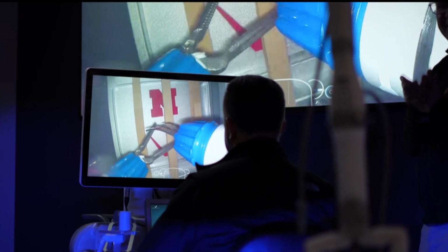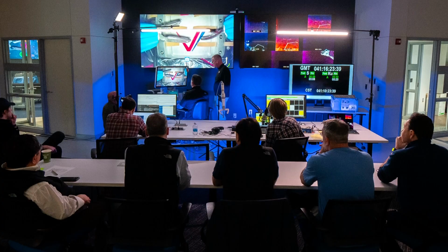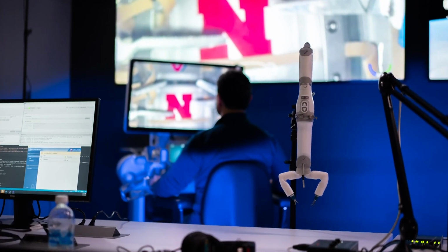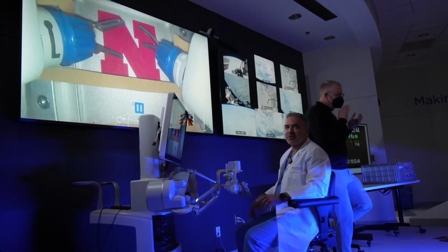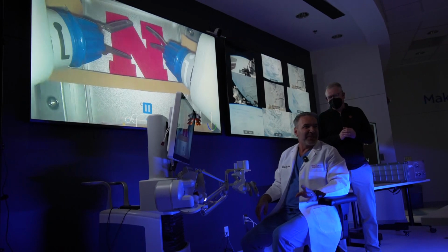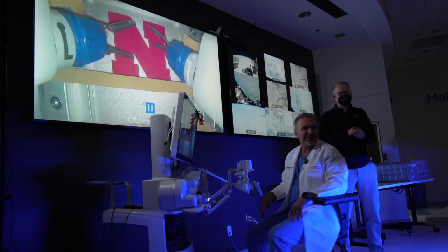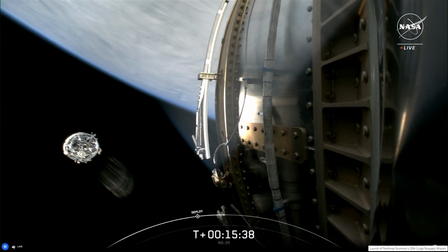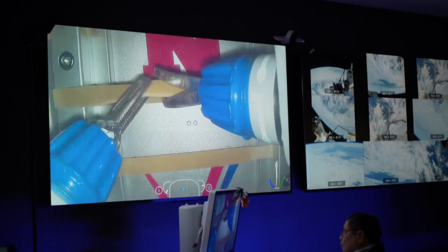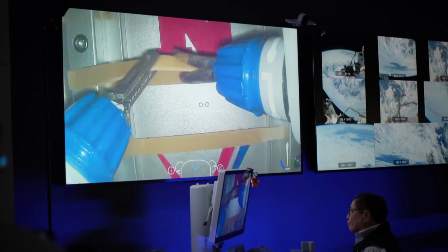Today's surgical robots typically take up an entire room. Space Mira is 2.5 feet long and weighs 2 pounds. One small rubber band, but a great leap for surgery. Yeah. This is the first step towards longer space flights, so astronauts could have an option in case of an emergency. It also opens the door to surgeries in hard-to-reach places, such as rural America.